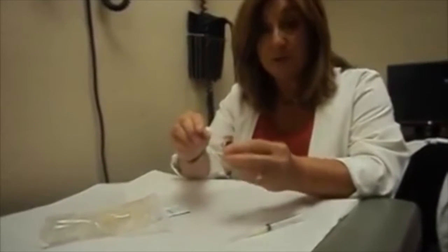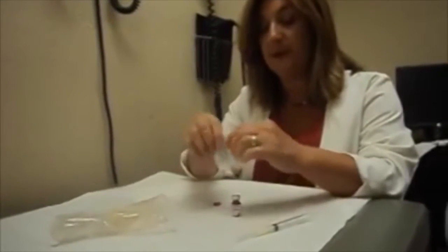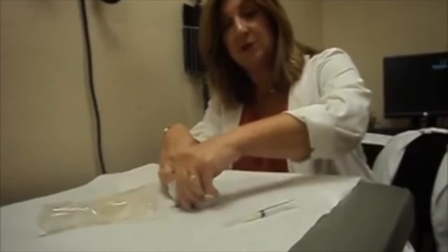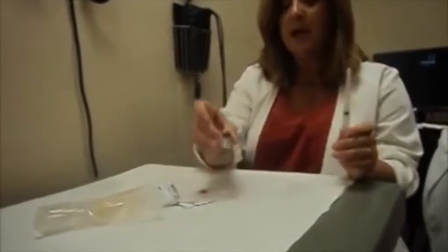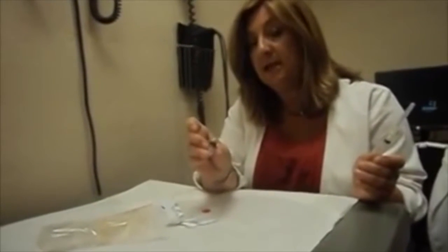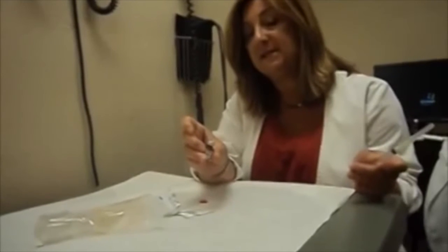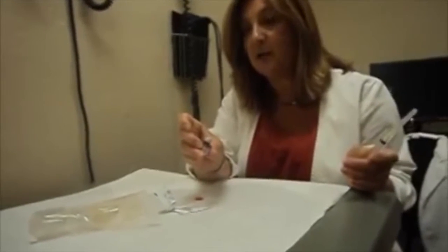If you're good at removing the top of your vial without touching the rubber stopper, you don't need to clean it, but to be on the safe side, what you can do is just give it a mechanical clean on the alcohol swab or the cotton ball you're using. With 1-dose vials, a little air needs to be injected into the vial so the medication will flow easily into the syringe. If it's a 10-dose vial, you will need your whole dose of air because the bottles are pressurized.